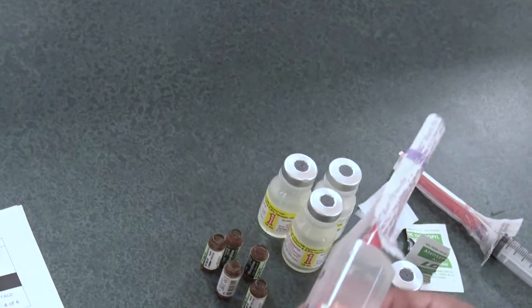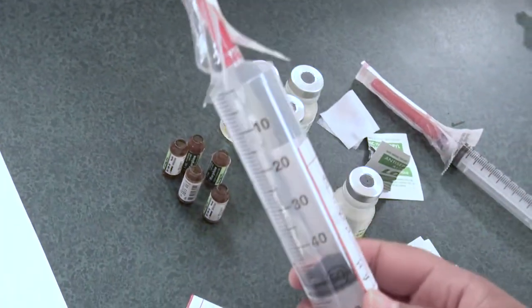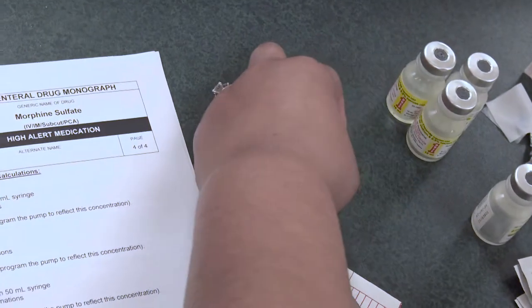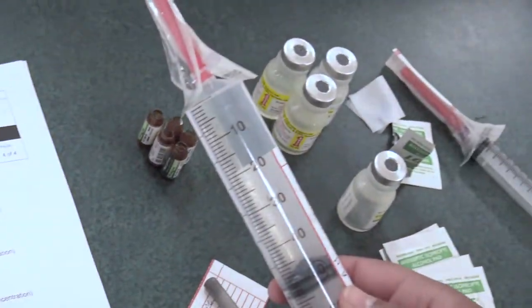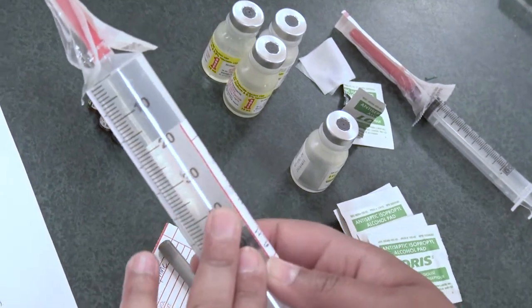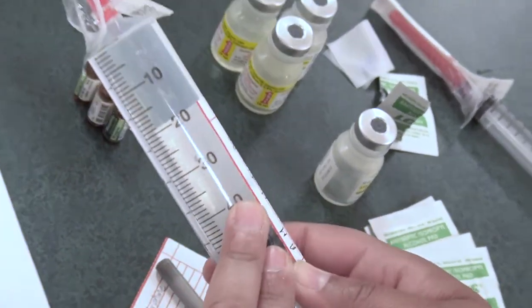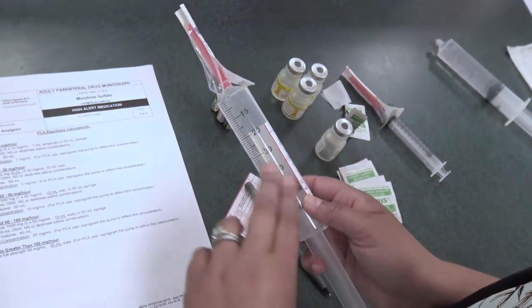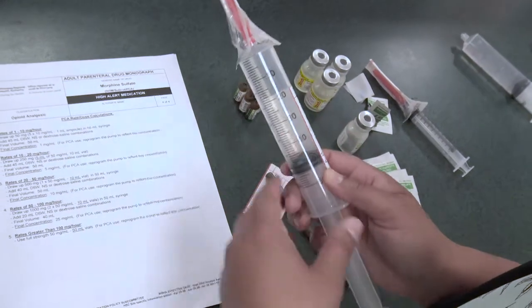Now that I have the label on, I need to get another nurse to double check the whole process and my drug, so that they're able to verify that I have reconstituted and diluted my drug for my PCA appropriately. This is a high alert medication. It is a 2-nurse check. You must have a nurse check at this point as well as at the pump.